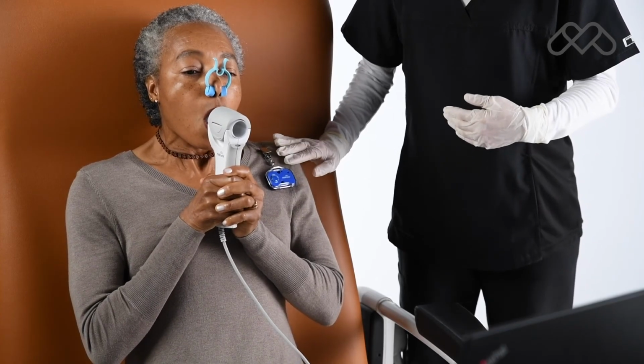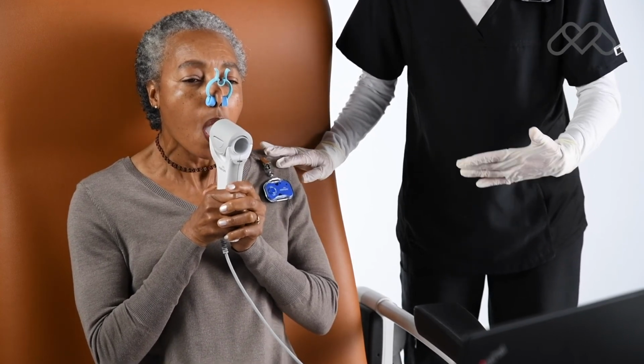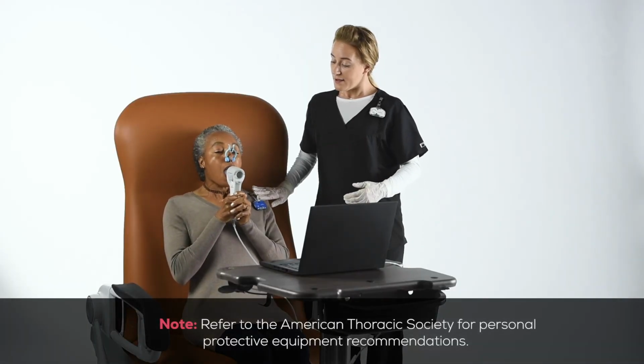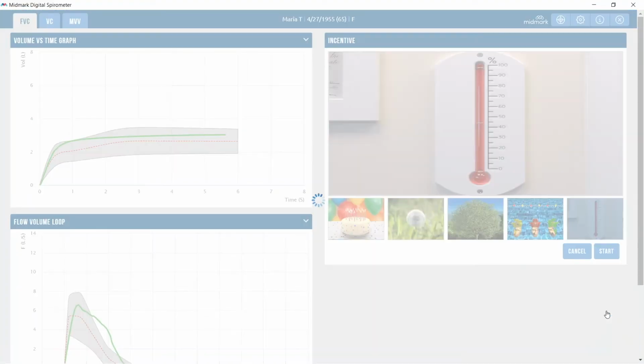Now, it's time to coach your patient and have them conduct their first maneuver. It is suggested that you wait at least 1 minute or until the patient is ready to perform the next maneuver. It is also recommended that you stand to the side of the patient to best support them during the testing process. When the patient is ready, click Continue to conduct the next maneuver.